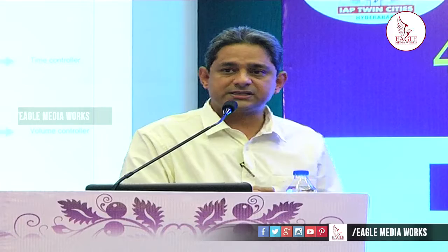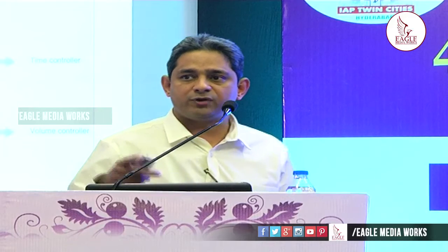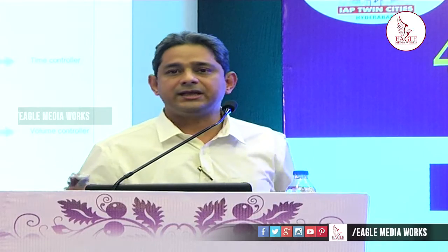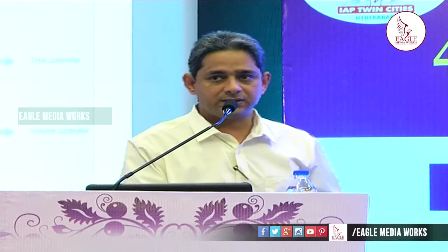So how is a breath defined? When you have a pressure waveform which doesn't change, it means it is pressure controlled ventilation, and your flow and volume will vary. And when you have a volume waveform where your volume or flow doesn't change but the pressure changes, that defines your volume control mode. So basically, out of the 4 parameters, one will be the control or set parameter, either the pressure, the volume or the flow. The others change as per the dynamics of the airways and lungs.